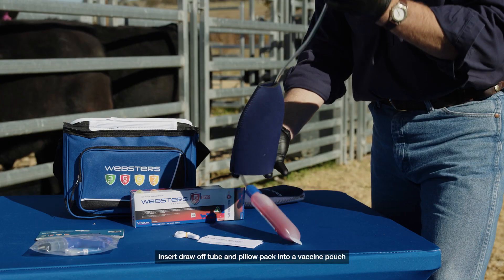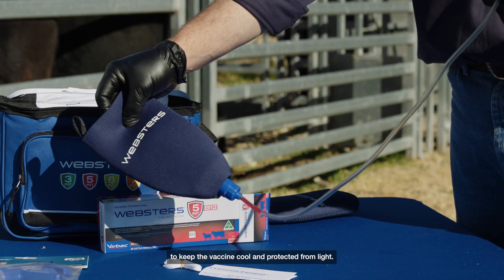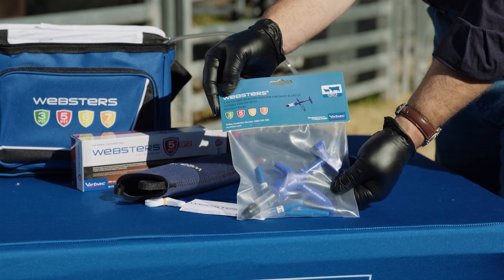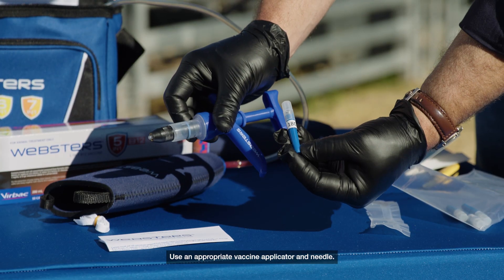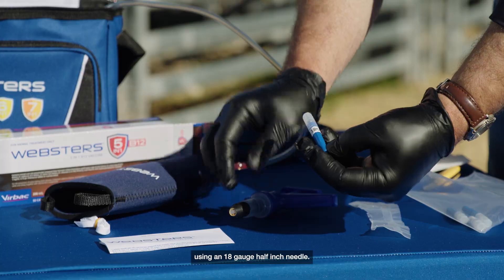Insert the draw-off tube and pillow pack into a vaccine pouch to keep the vaccine cool and protected from light. Use an appropriate vaccine applicator and needle. Most cattle vaccines are administered using an 18-gauge, half-inch needle.